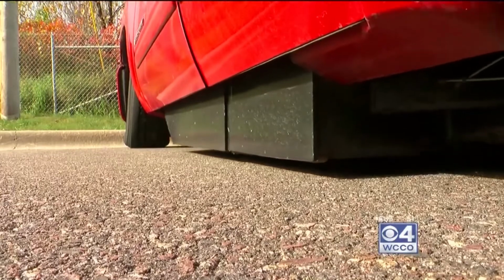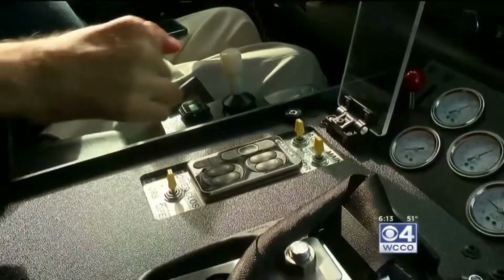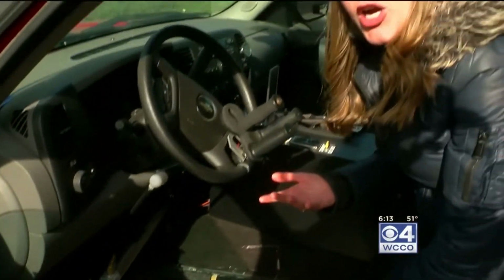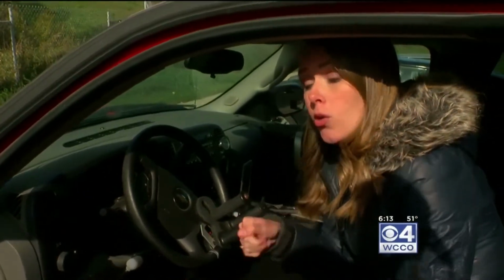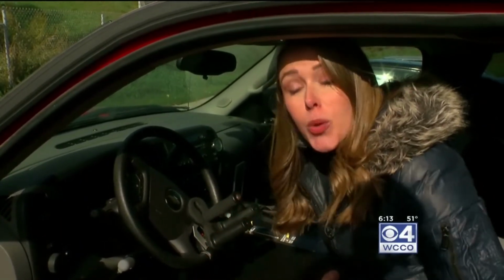It took a few years, but Phil, who's a mechanical engineer, came up with the idea of KAS, kneeling air suspension. If you're sitting as a passenger in the vehicle, you wouldn't notice anything, but you can see in the driver's seat, he's cut out the frame so he has room for his wheelchair. And if he wants to get out of the truck, he simply uses a remote control, so it will lower all the way to the ground as there are air springs underneath each wheel.